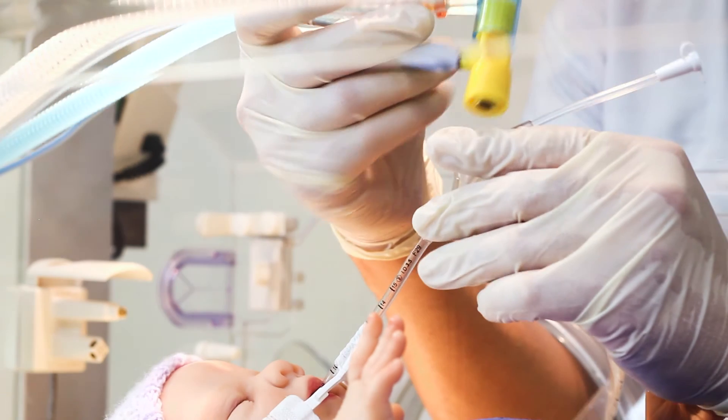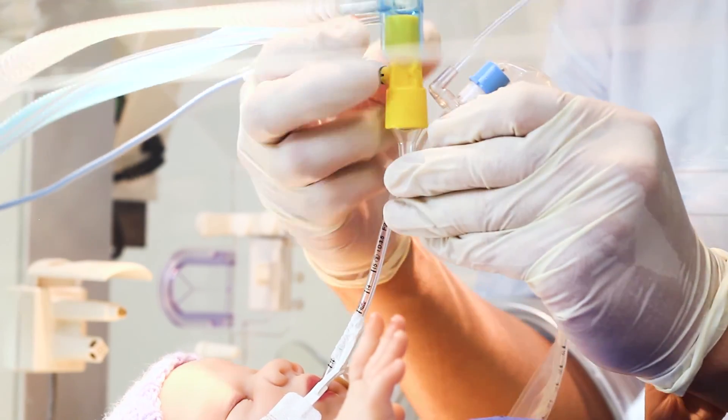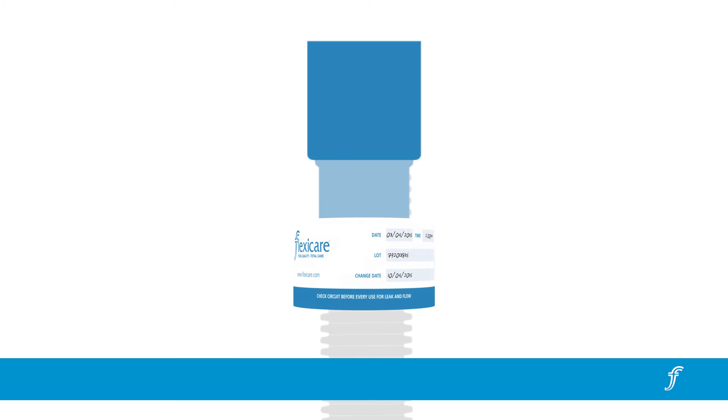Finally, connect the patient end of the breathing circuit to the patient airway or delivery device and begin ventilation. Complete the enclosed self-adhesive label, noting the date, time, lot number and change date of the breathing system, and attach to the end of one of the limbs.